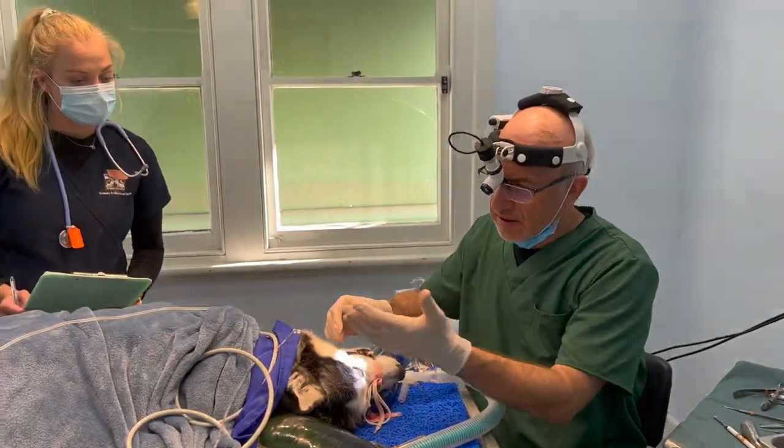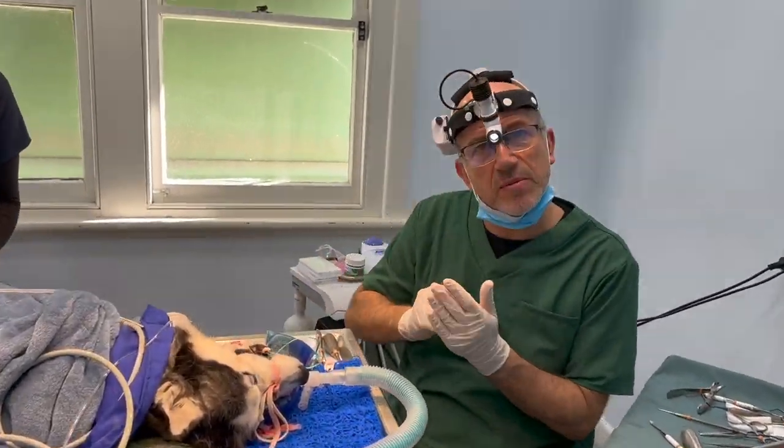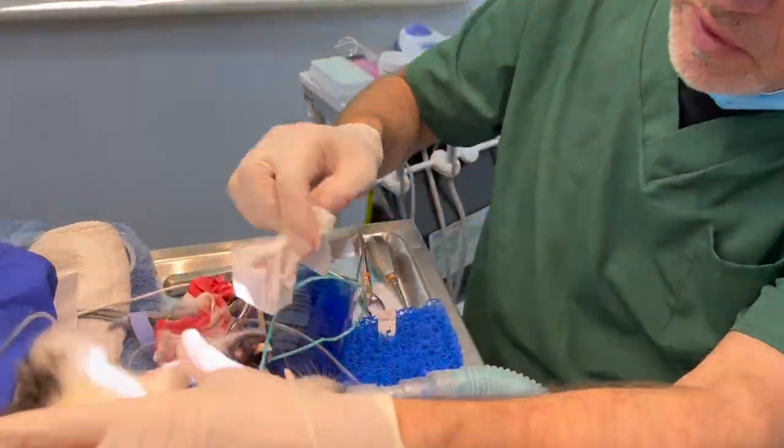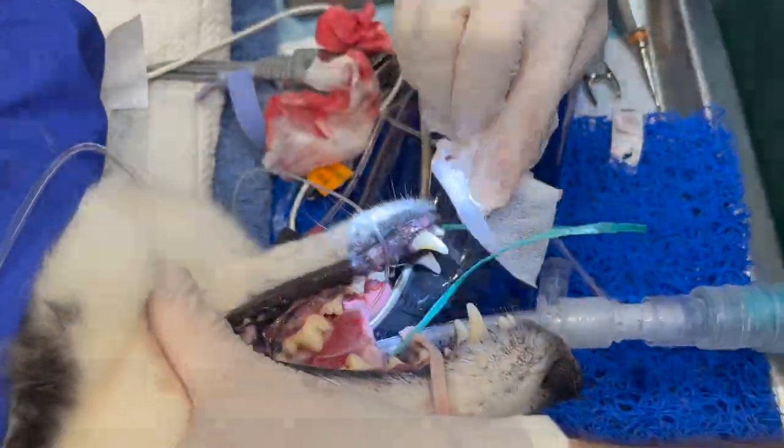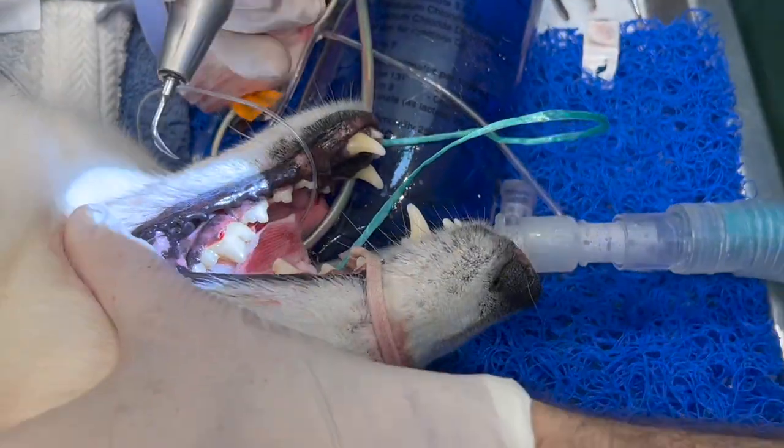On top of that, we're going to scale and polish the mouth and get it really beautiful — a really clean oral cavity. This is an ultrasonic scaler. You can see that I'm scaling.